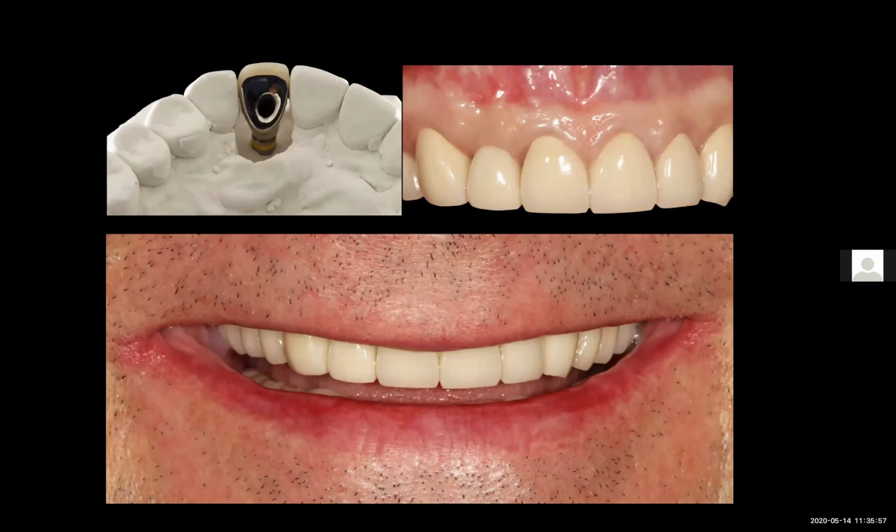We have a thick band of attached keratinized tissue around the implant to protect against recession. We have what I call an implant triad. One is that we have a correct implant position. Second is that we have a healthy peri-implant soft tissue. And third is that we have a proper emergence profile on the restoration that mimics the shape of the root coming out from the alveolar process. Those three triads are the cornerstone in helping the patient maintain peri-implant hygiene long-term. And as you can see, despite having a metal ceramic restoration, we achieve a good aesthetic result.